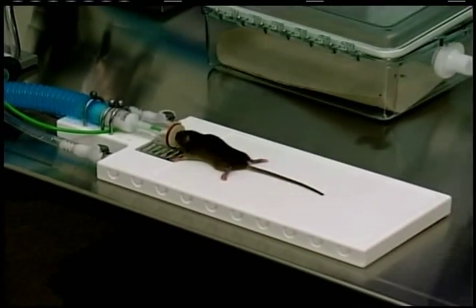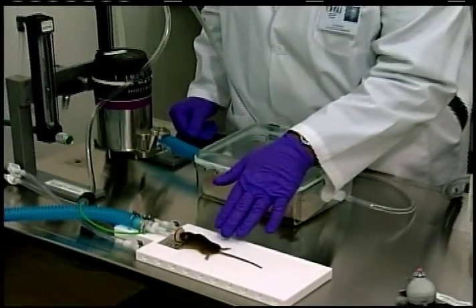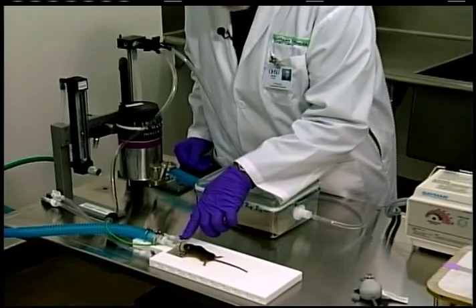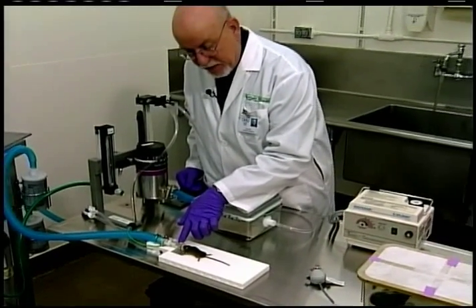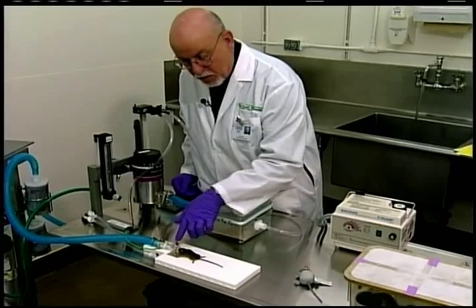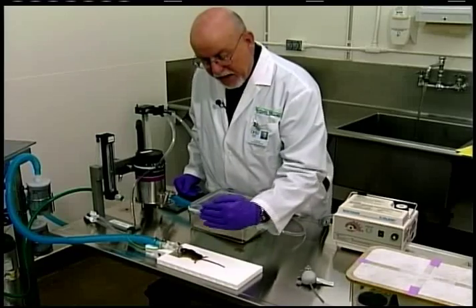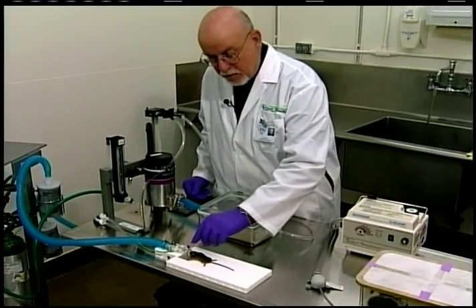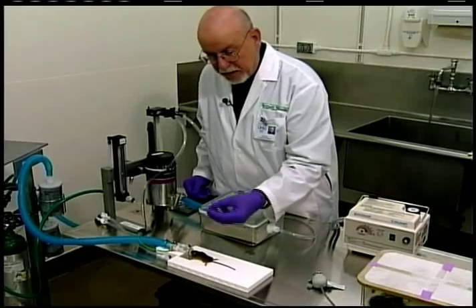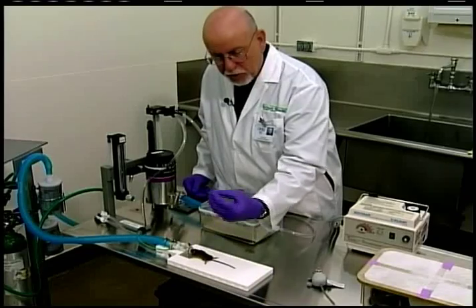These little guys are obligatory nose breathers when they're in their sternal recumbency. There's no problem, and you don't have to put his whole head or his whole mouth inside of the non-rebreathing nose cone. It's simply getting his nares in there. If you have the animal on the dorsal recumbency, however, we urge you to have the nose and the mouth inside the nose cone, because there's an opportunity for them to do some mouth breathing.